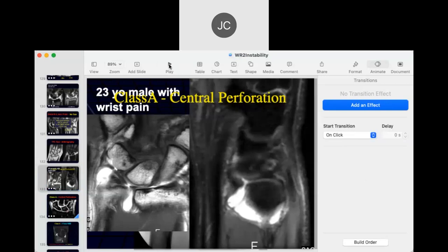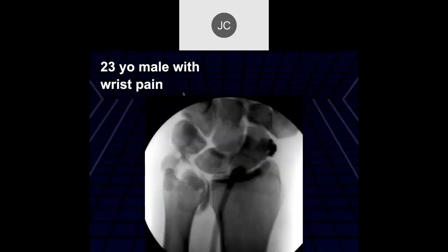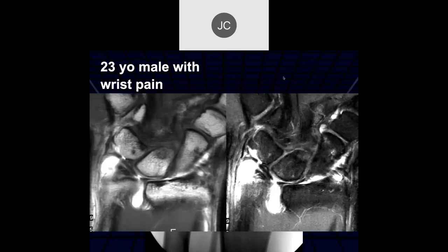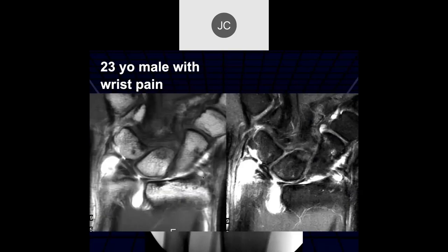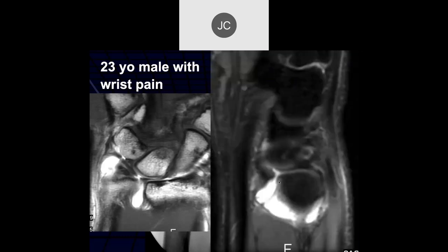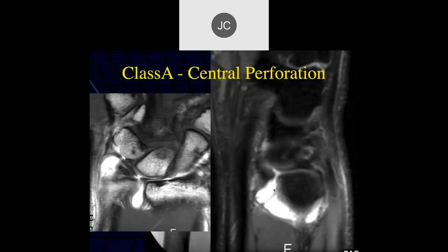Okay, we're back on now. Here we can see a positive arthrogram and the MR scan showing the contrast extending through a central perforation with a complex tear. Sagittal images show it's really occurring in the volar aspect of the triangular fibrocartilage — this was a Class A or central perforation.